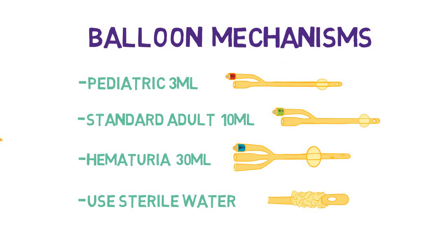Whenever you are repositioning or removing catheters, it is important to check how large the balloon is. This can be found on the hub where the sterile water is instilled. Additionally, it can be important to check the charting and documentation at the time of insertion. Sometimes balloons are not fully inflated, and occasionally, on rare circumstances, they can be overinflated.